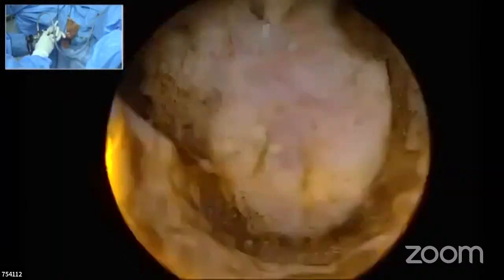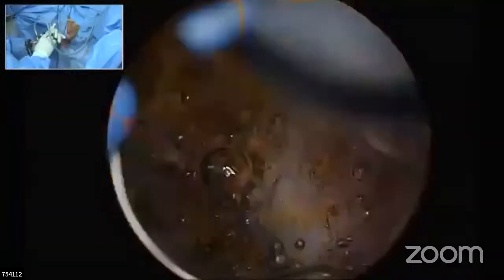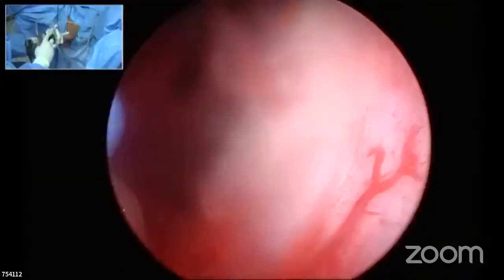Half distension is the ideal area. Sometimes you end up with a capsule which is folding up on itself, and that is the reason why you end up coming out of the capsule.